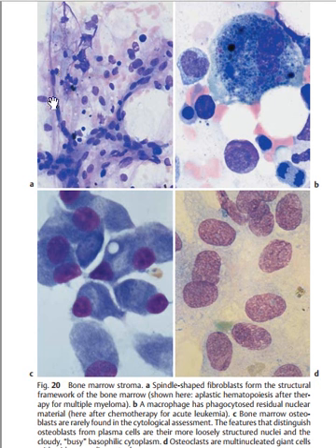So we also have some fibroblasts which are spindle shaped, as you can see here. These are spindle-shaped fibroblasts here, elongated. When I say spindle, it's just elongated. So these are spindle-shaped fibroblasts. They form a structural framework there, and you can also visualize some connective tissue. So these are loose connective tissue that you're going to visualize. Is it clear? So that is the first diagram.